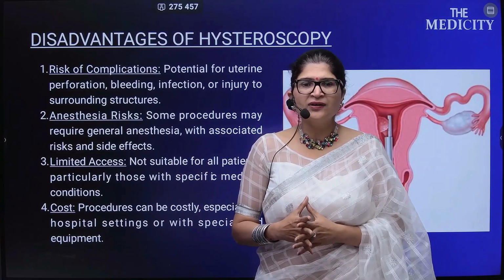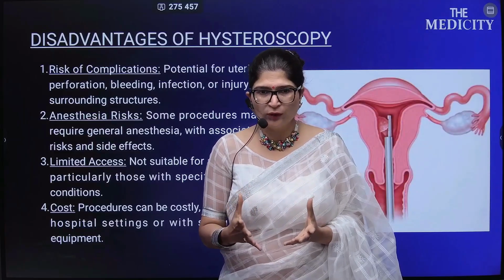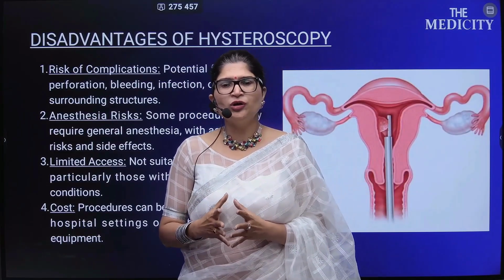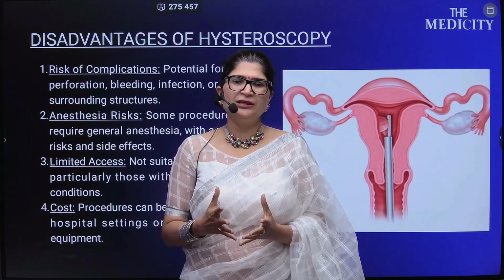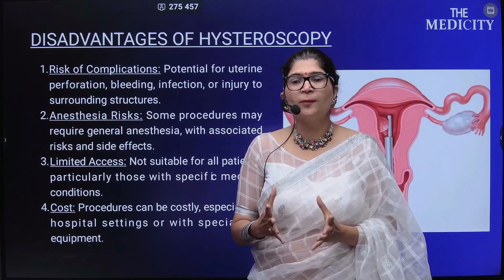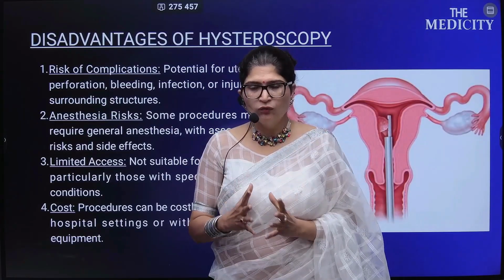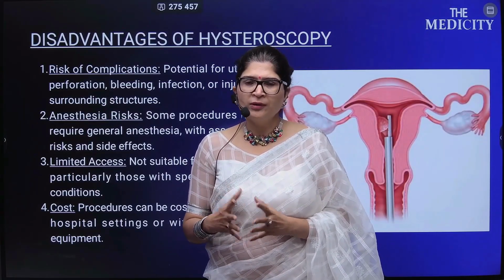Limited access: it is not suitable for all patients, particularly those with specific comorbid conditions. About the cost, procedures might be a little costlier compared to open surgery in hospital settings, and this has to be properly conveyed to the patient. With the advancement of the procedures we are doing on the patient, the overall cost and overall recovery time might be less.